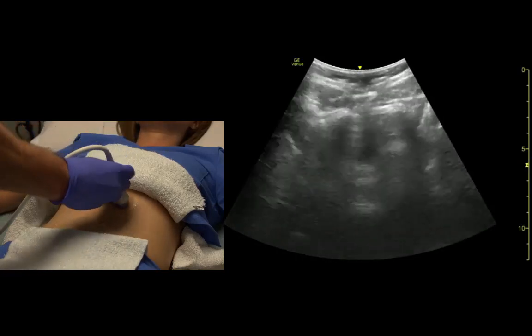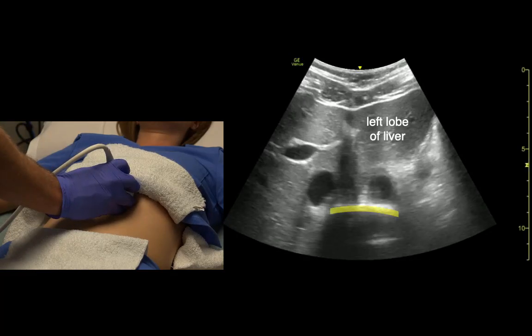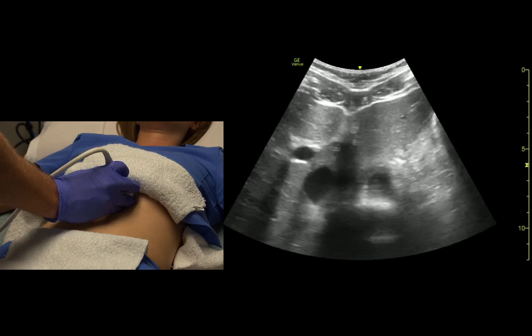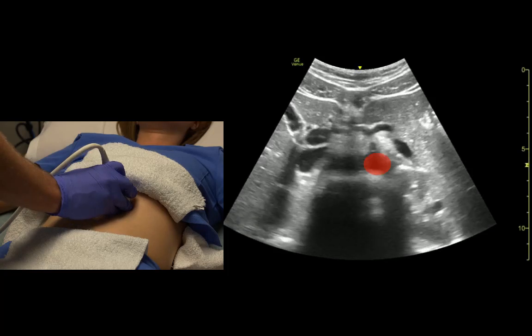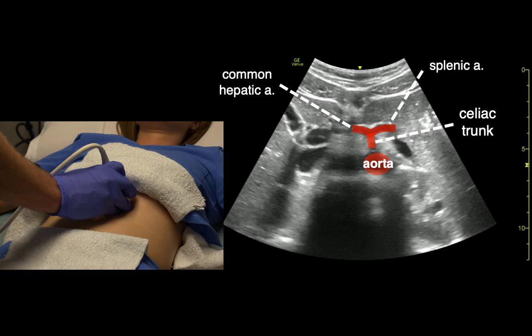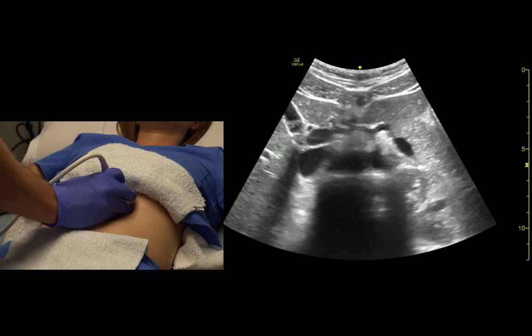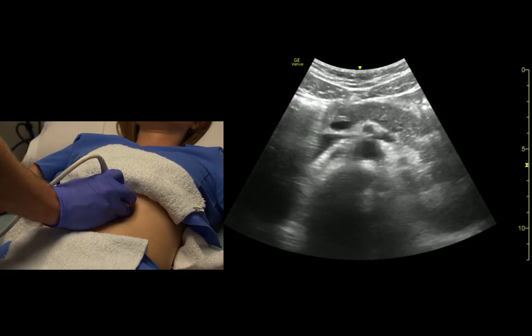Transverse in the mid-abdomen. We start very high, come down through the left lobe of the liver. Here's the celiac trunk — the little seagull right there. And then just below that is the pancreas.